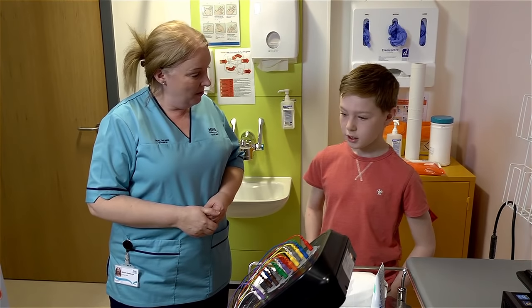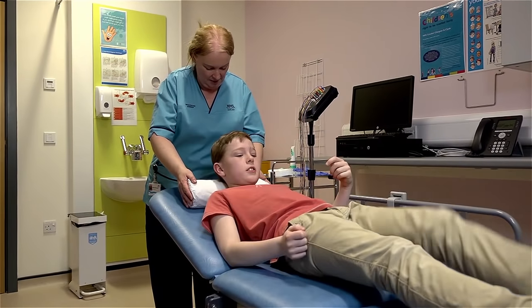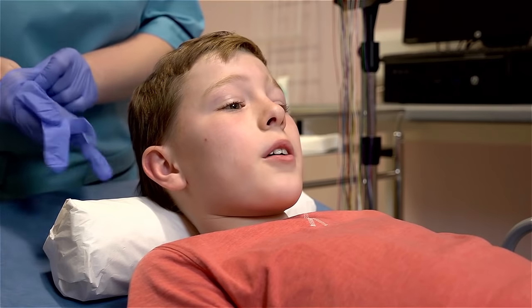So would you like to hop up onto the bed? Yeah, sure. And we'll get started. I'll put this little pillow behind your head just so you're comfy. Is this going to hurt? Not at all. These little leads just sit on top of your head.